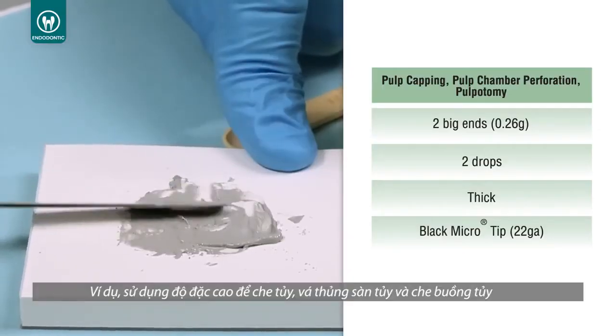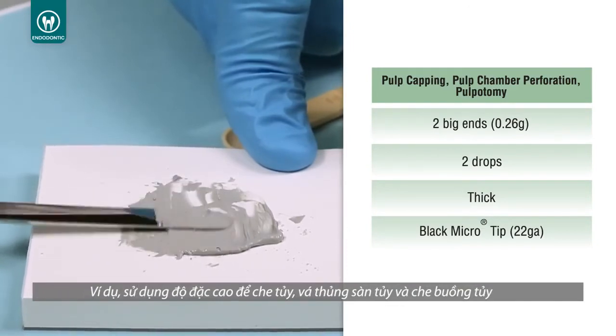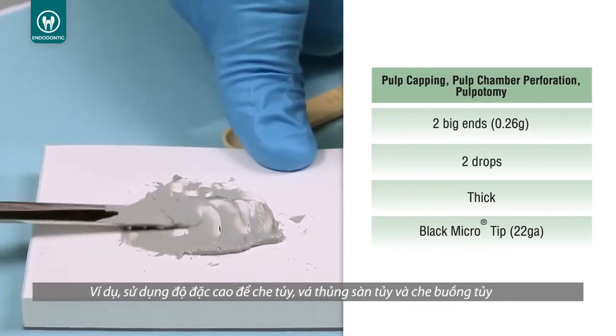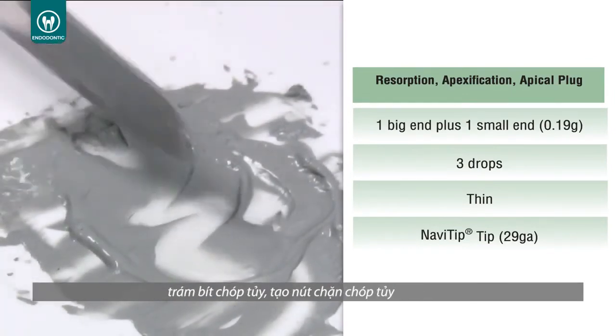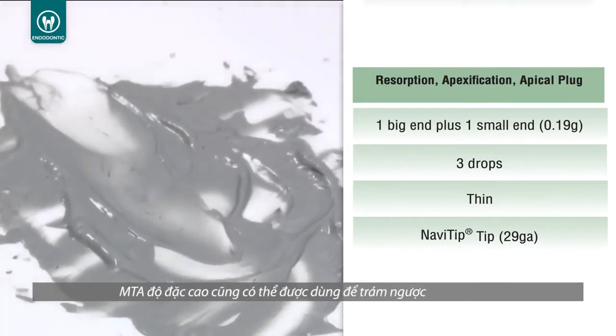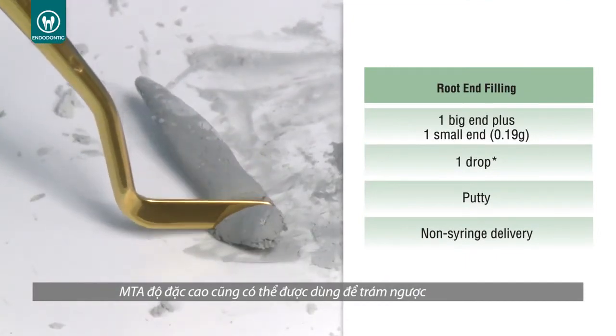For example, use a thick consistency for pulp capping, pulp chamber perforation, and pulpotomy. Use a thin consistency for resorption, apexification, and apical plug. A putty consistency can be used for root end filling.